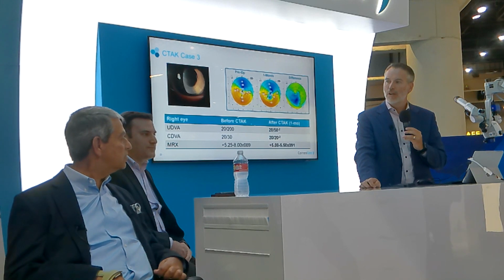No, it really is an iterative process. And we are constantly working with our software technician to almost use a machine learning type of approach to make it better and better. And right now we're looking pretty good with what we have, but there's continuous quality improvement, as they say. Well, and that's the thing that's exciting about this, because it's customizable. And you don't have to design lock something to take it through an FDA approval process. We're doing a customized procedure to get the cornea to where we want it to be.